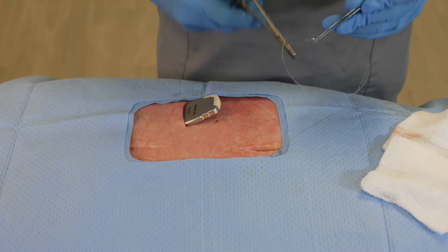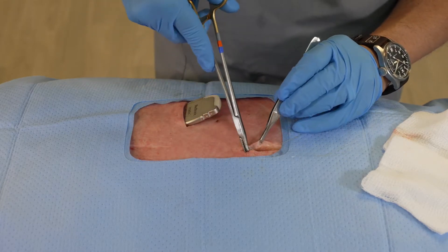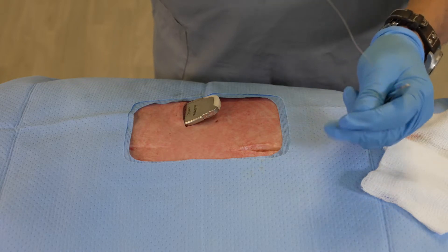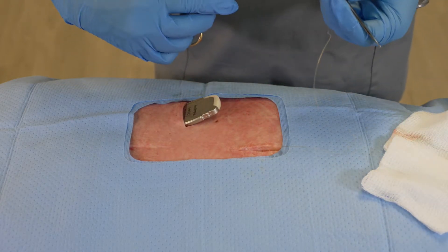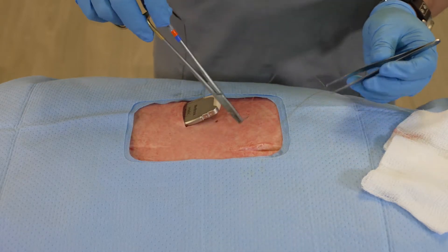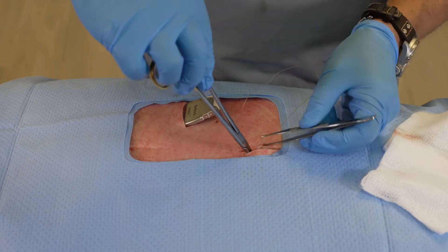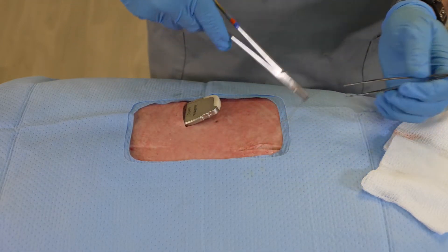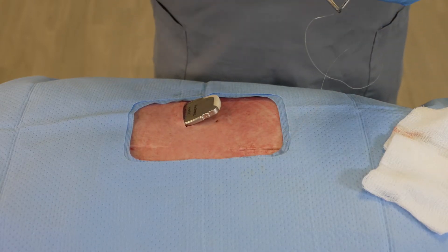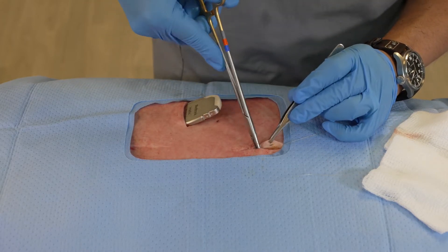One of the big advantages here is that I do not have to pull very hard on the suture in order to achieve strength and stability, but rather just a slight tug to ensure that I'm approximating evenly across both sides. It's important to maintain equal depth as you come from each side.